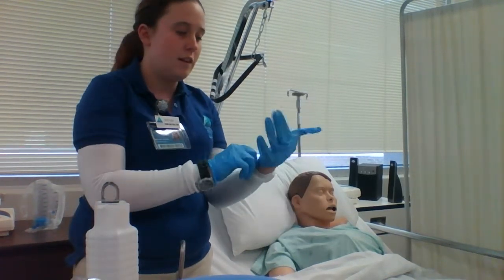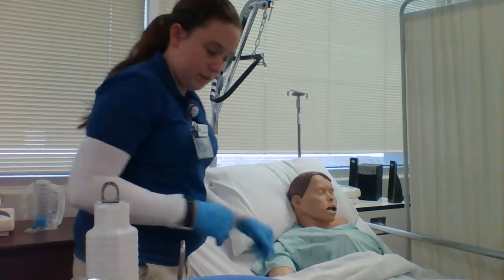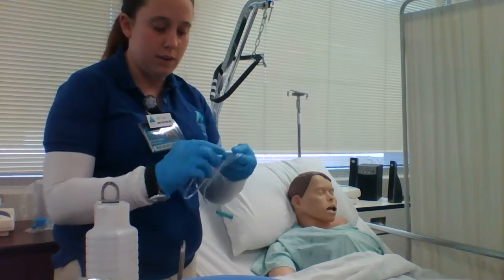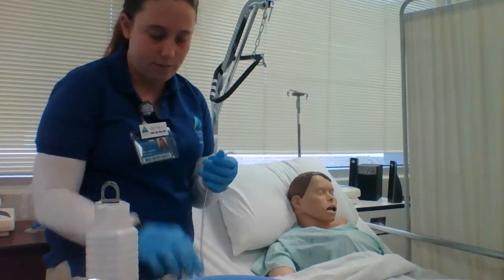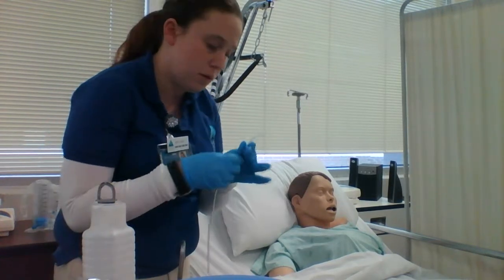Okay, gloves are on. Alright, and now I'm going to lube the tubing from the distal end down to 4 inches. Alright, it is completely lubed.